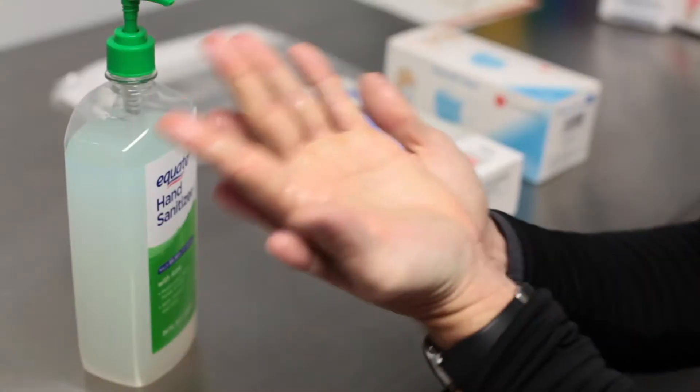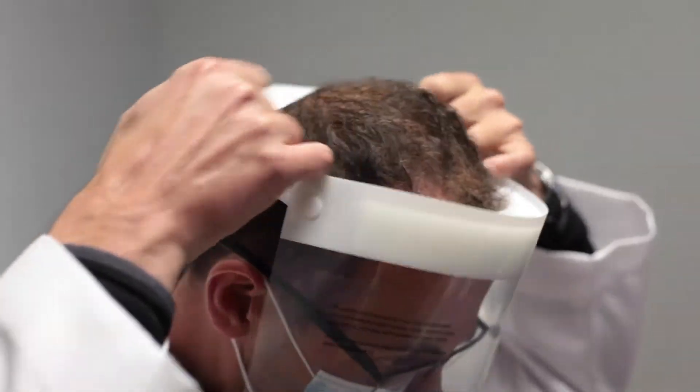In order to take a collection, you must first properly sanitize your hands, put on gloves, a mask, face shield, and lab coat.